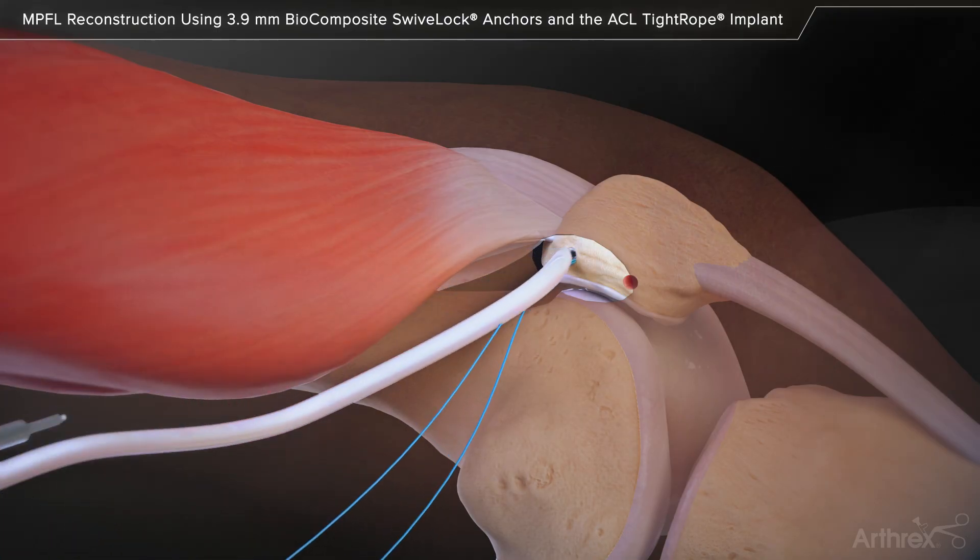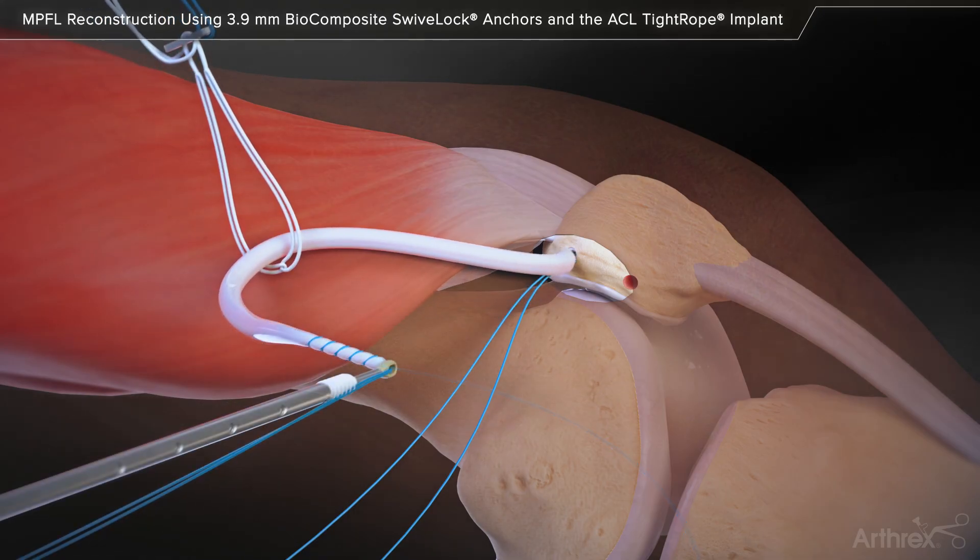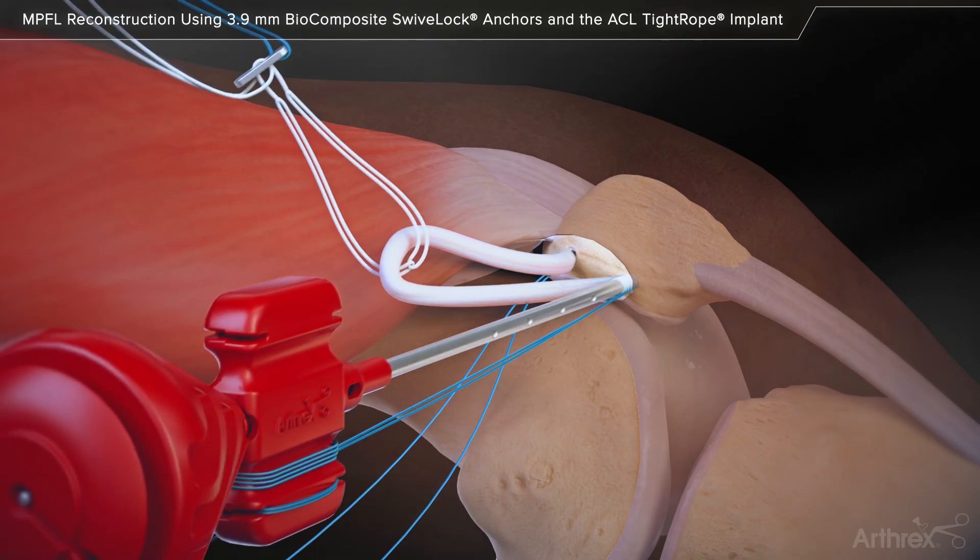Before inserting the second swivel lock anchor, loop the tightrope implant over the free end of the graft. Repeat the swivel lock insertion procedure with the second graft end.